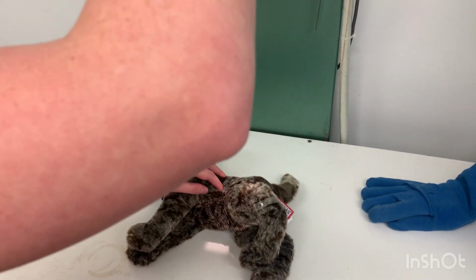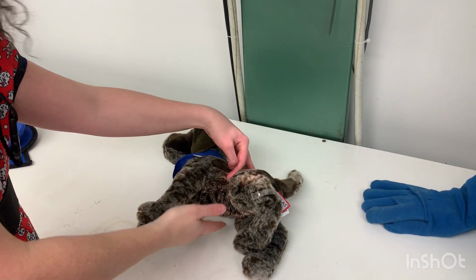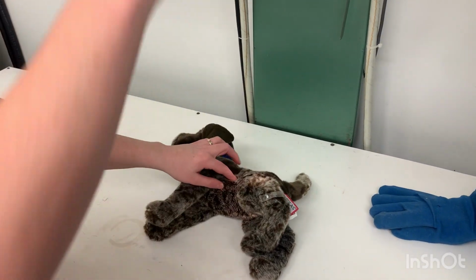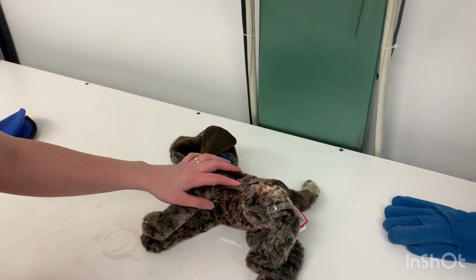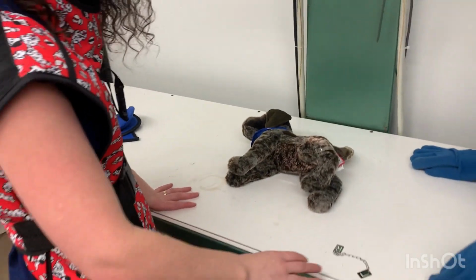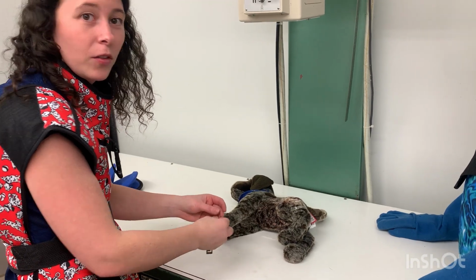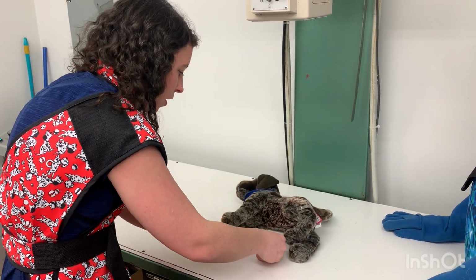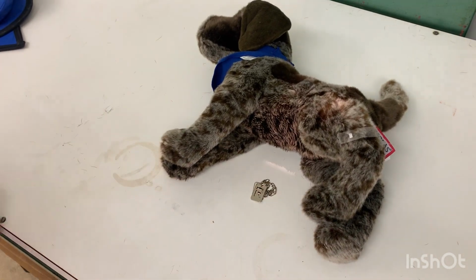And then we can take it down a little bit this way, because we don't need to have everything exposed out this way, and taking it down will decrease the scatter that we have. So that's important to do there as well. So that's about what we need. So we're about good there. And then we're right lateral. So we're going to put the marker on here. So this is the right.